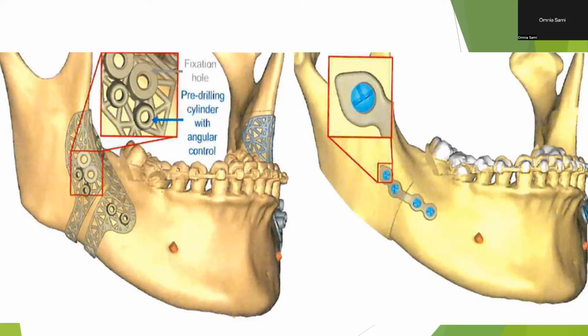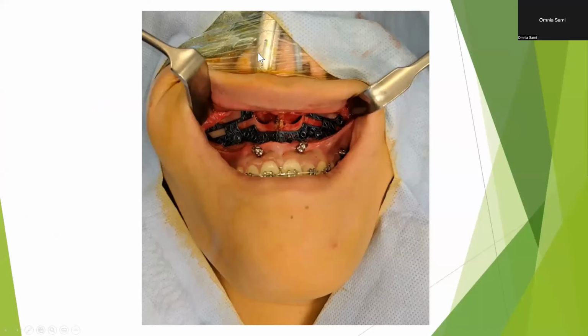The cut is where you put the cut. And a sagittal split can be done without the need for a cutting guide. And I think these cutting guides for the mandible complicate the procedure far more than they simplify it. So just some clinical cases here. This is a young man with the cutting guide in place.